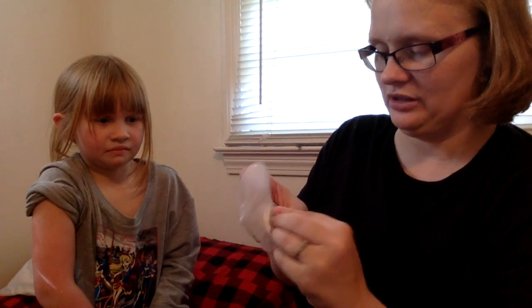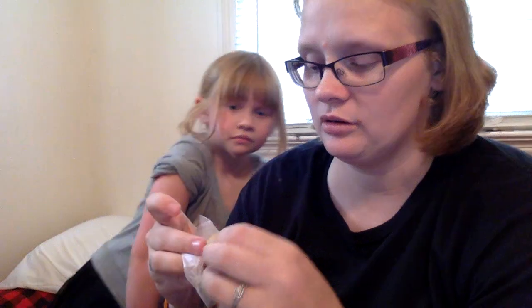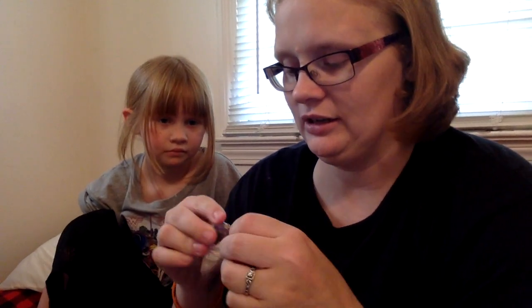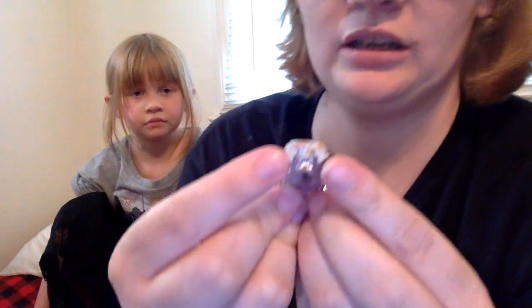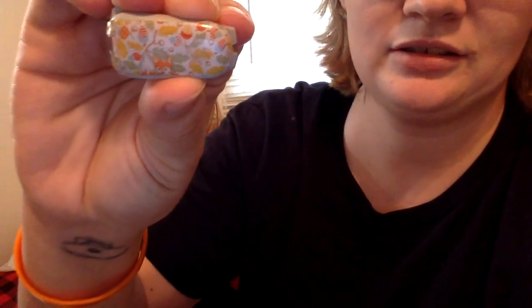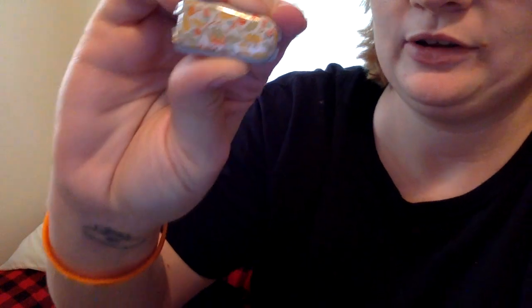Now we have to dig out our sensor. Now the new sensor will have this little thing, I'll show you in a little bit, to take out the transmitter on this to put into the new one. However, I have found that it's just as easy, if not easier, to take either side of the base right here and just pull it apart and it pops right out, just like that. And as you can see, she's got her little foxes on there with her leaves. This is one of my Jamberry nail wraps that I put on here.